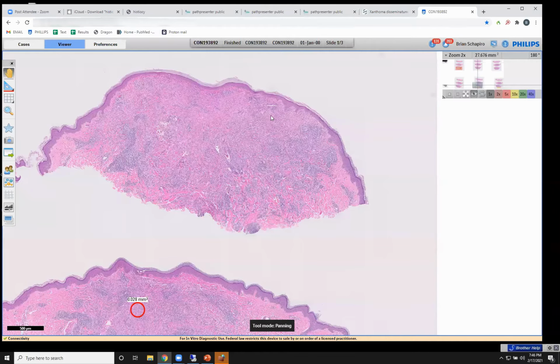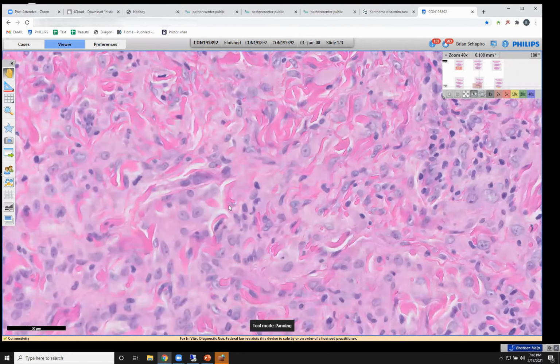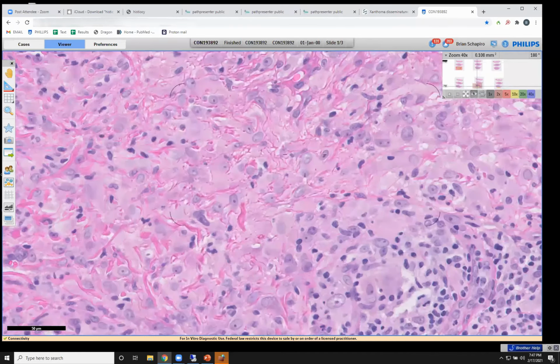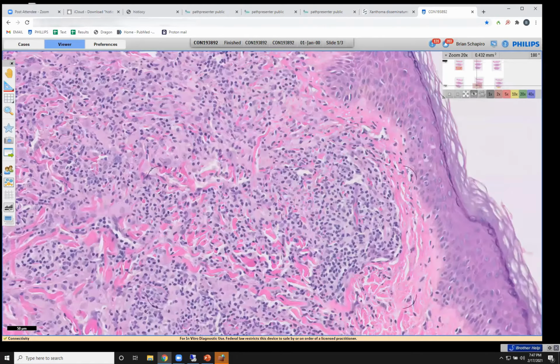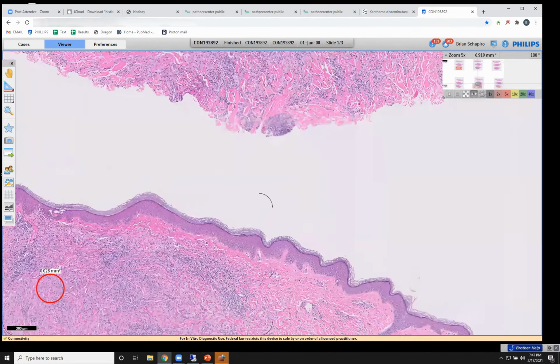So this one's the same, but yet a little different. Again, a shaved biopsy, epidermal atrophy, a little bit of hyperorthokeratosis, and a dermal process with mononuclear cells and lymphocytes. And these cells, you can see, have this pink cytoplasm. They don't have the foaminess. So this one would fit into the reticular histiocytoma or multicentric reticulohistiocytosis. You can think of a Spitz over here. Big nuclei, distinct nucleoli, pink cytoplasm. And again, the usual mix of inflammatory cells, lymphocytes mainly. So this was a reticular histiocytoma.